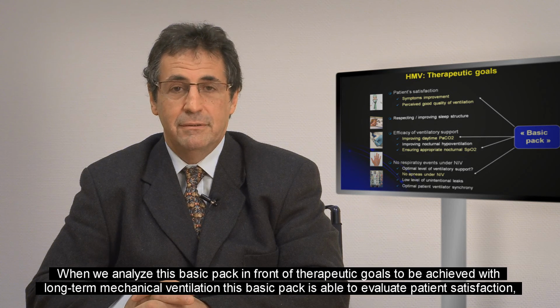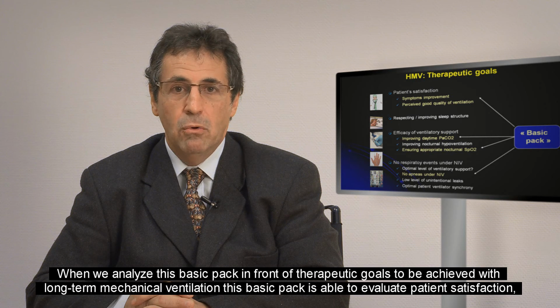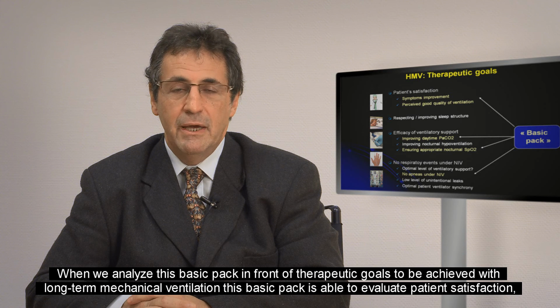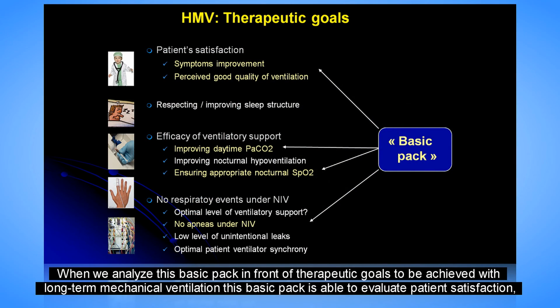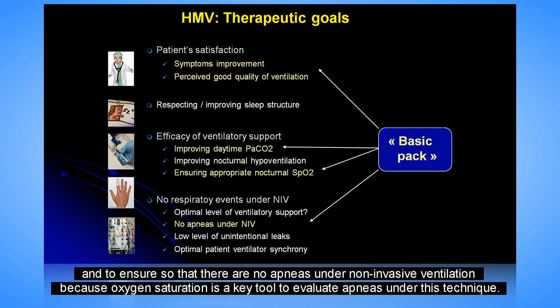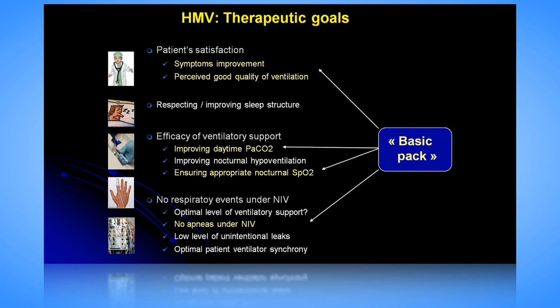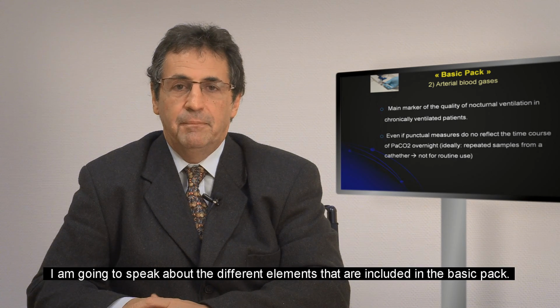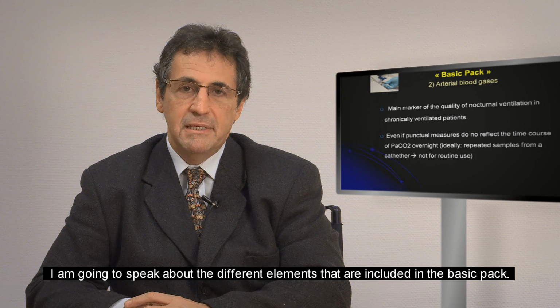When we analyze this basic pack in front of therapeutic goals to be achieved with long-term mechanical ventilation, this basic pack is able to evaluate patient satisfaction, diurnal PCO2, SpO2, and to ensure also that there are no apneas under non-invasive ventilation, because oxygen saturation is a key tool to evaluate apneas under this technique. These apneas are expressed as saturation dips under ventilation. I am going to speak about the different elements that are included in the basic pack.